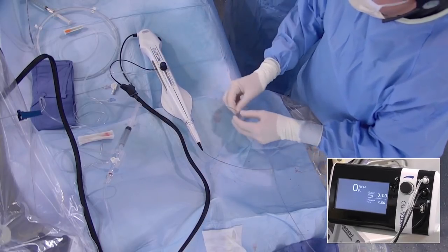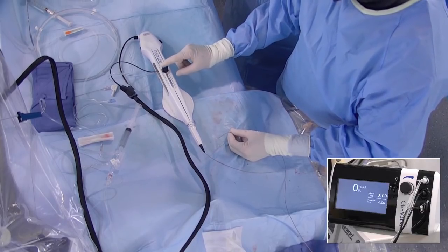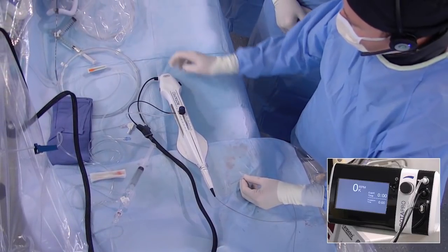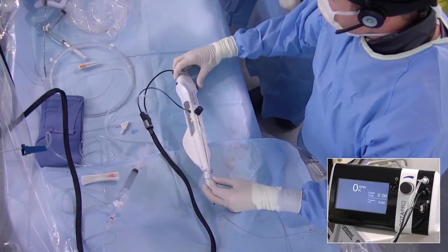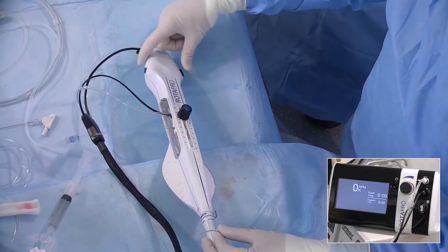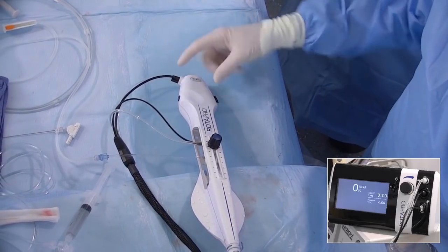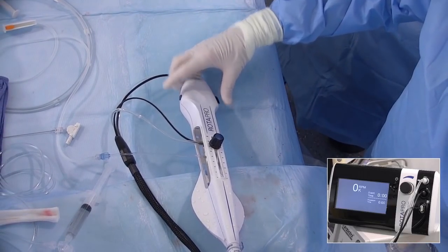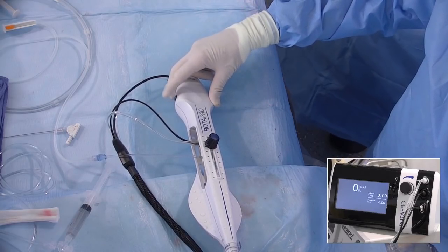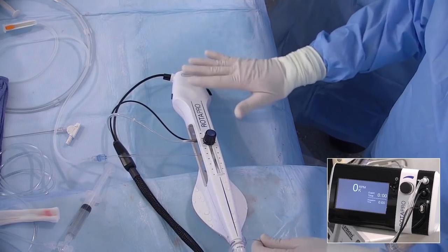To use it, if you push this blue button, you start the burr. And there are two buttons, because when you start the burr, the wire is trapped, and to remove the trap, you have to push these two buttons, which also induce a small speed when you want to remove it. But we will show you this after.